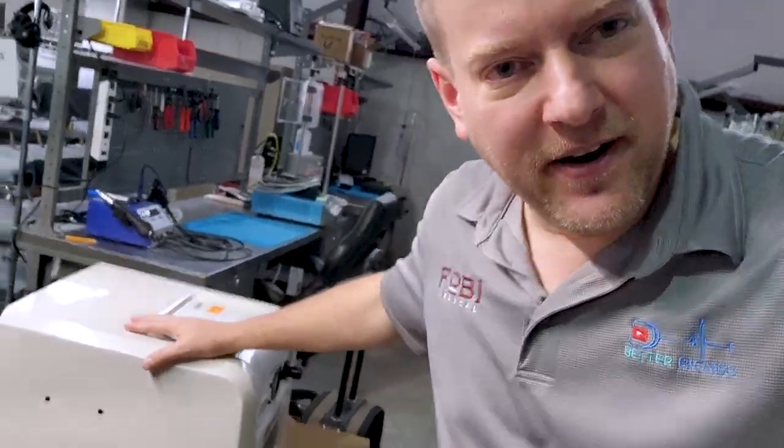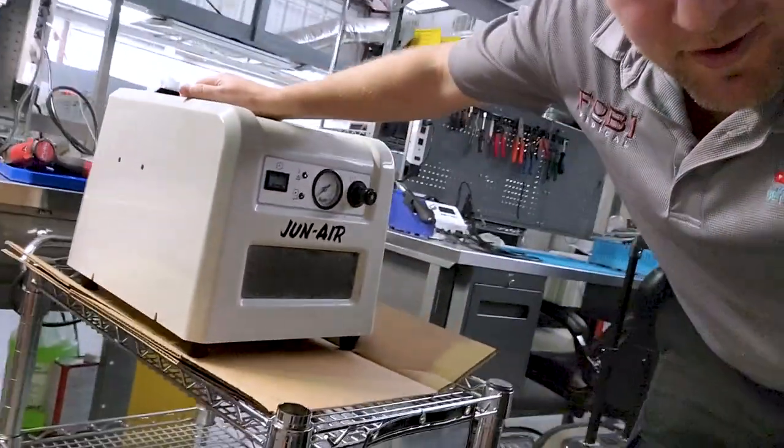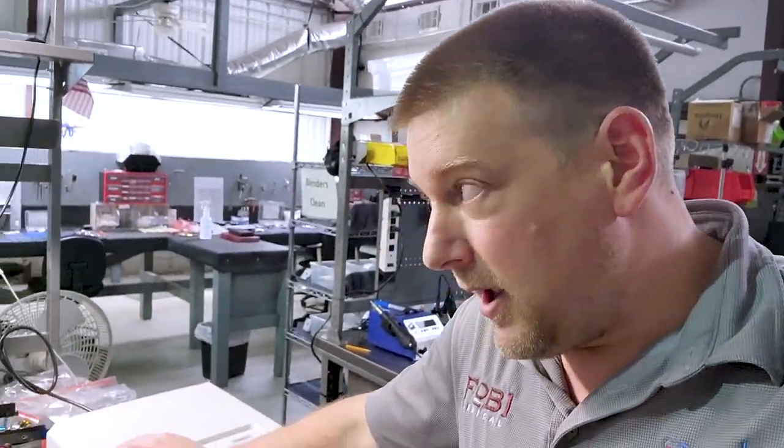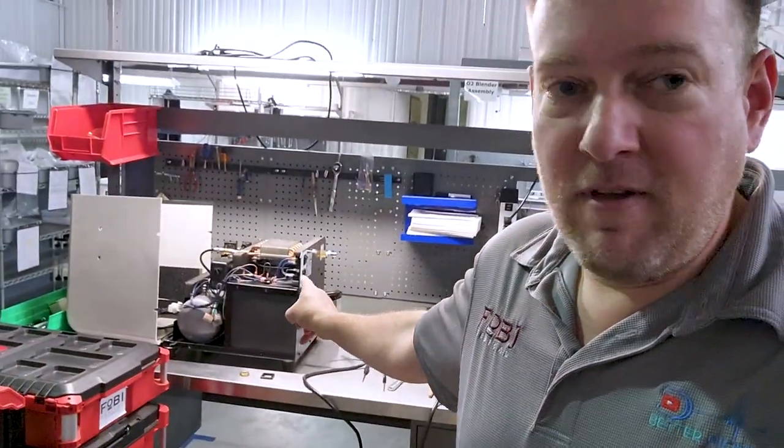Today, we're going to work on these very expensive, kind of complex air compressors. But they're really not that bad. We're going to go ahead and go through the insides, show you how they're supposed to work. And I've got one that definitely has a serious problem. Let's go ahead and take a look.